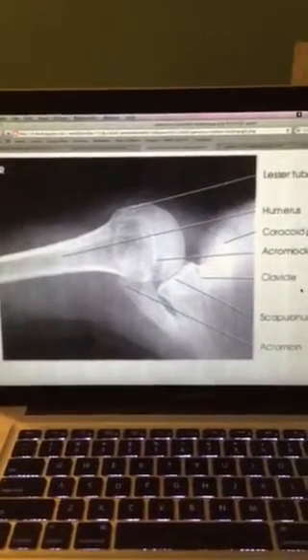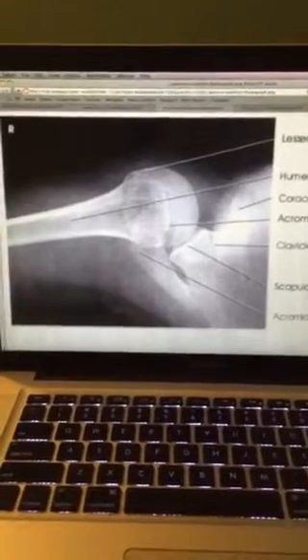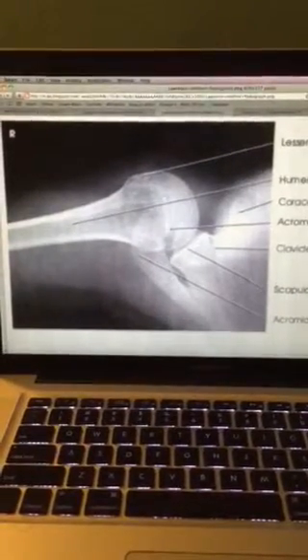This view is the supra-inferior axial projection of the shoulder joint. Here the central ray is angled from 5 to 15 degrees through the shoulder joint and toward the elbow. For the evaluation criteria, we are looking for evidence of proper collimation.